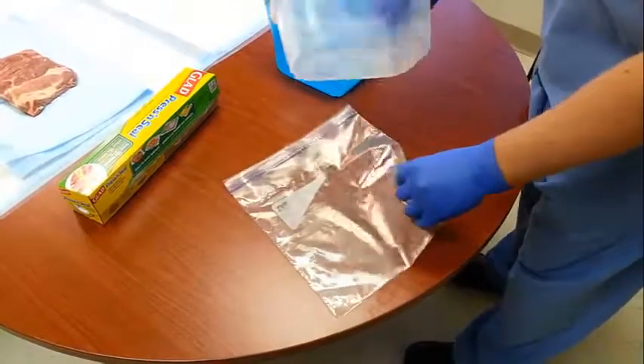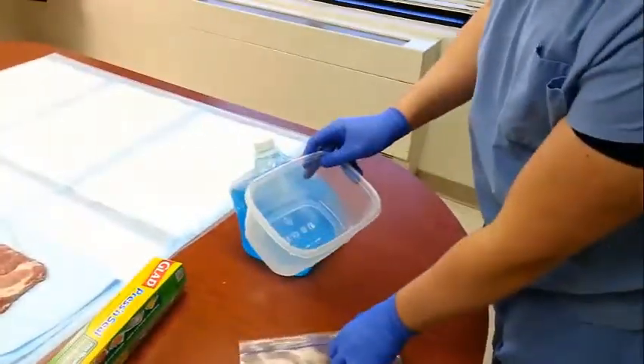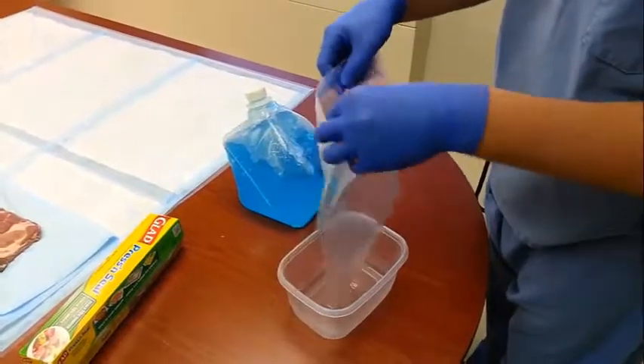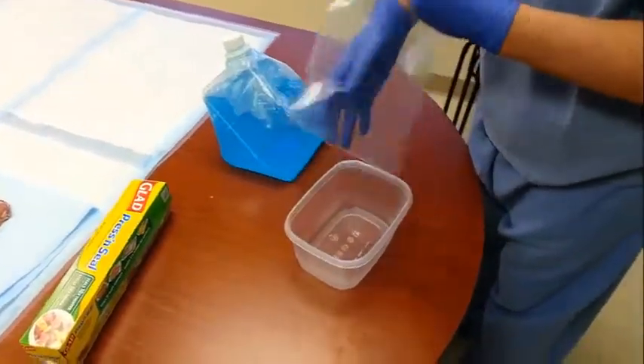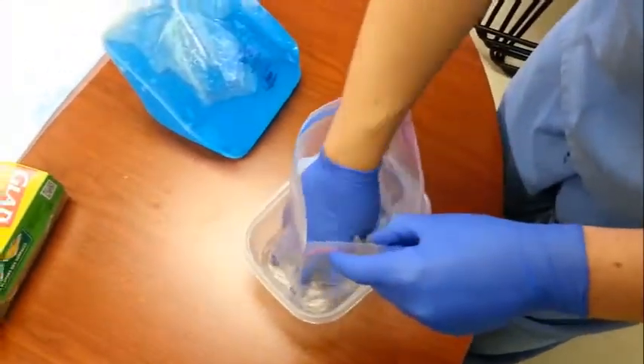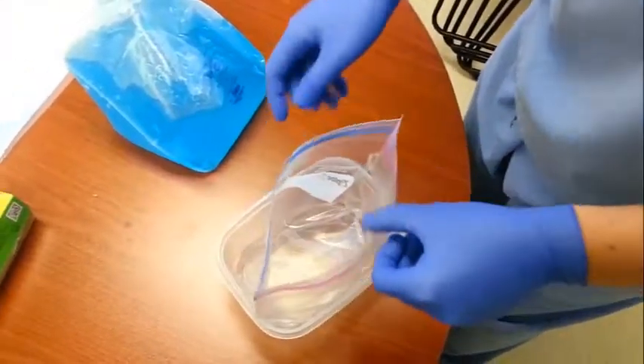As a prep step, take your leftover container and your gallon ziplock freezer bag, and place this in here just to be your receiver for your heart balloon. Leave that off to the side.